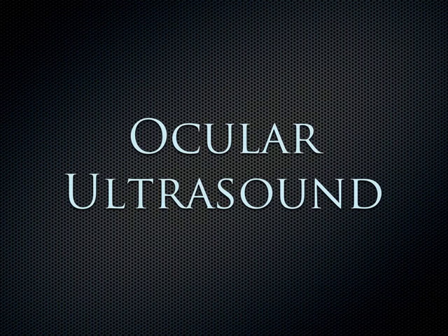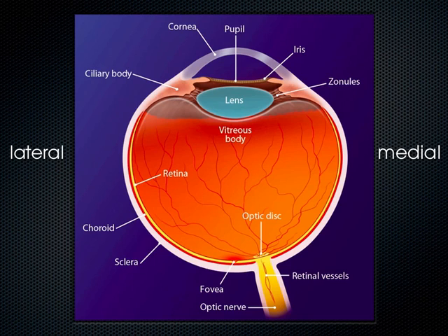Very briefly now, we're going to talk about ocular ultrasound, and the most important thing to keep in mind regarding the anatomy of the eye is that the ora serrata is seen here anteriorly. This is where the retina is attached, right out here at the ora serrata. It's also attached always back here, just about always at the level of the optic nerve. So it's always tethered here at the ora serrata, and then back here at the level of the optic nerve. This is the fovea of the eye. Here we can see the optic nerve coming down here with its vasculature.